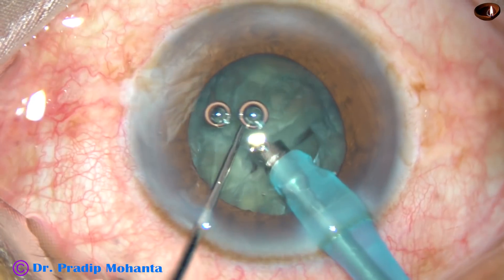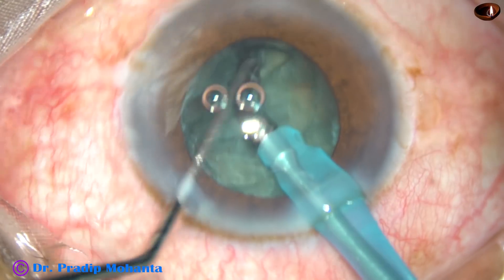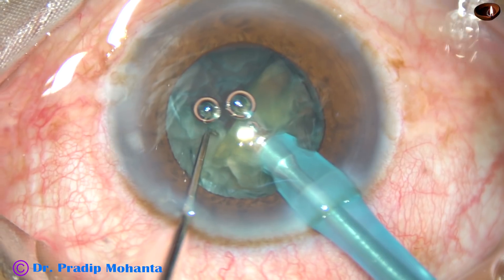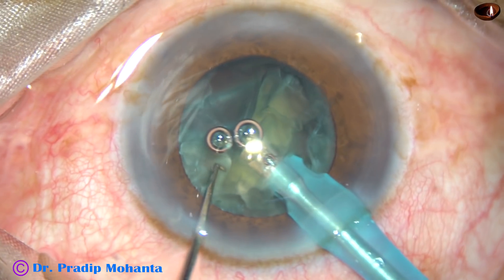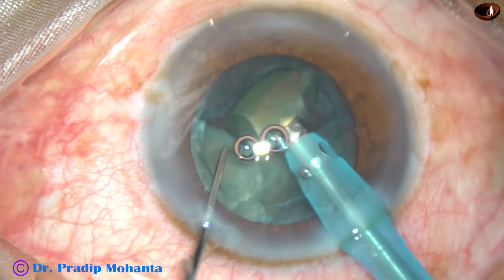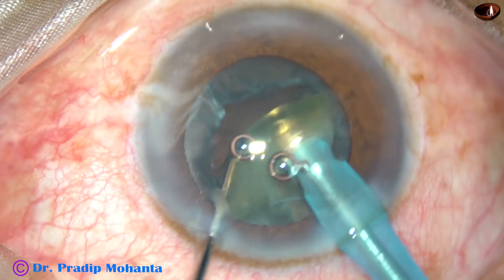If I apply vacuum, it will just remove the lens matter in front of the tip. So just bury it in the pit, support the nuclear mass, and use the chopper to slice the nucleus. This is the way for nucleus sclerosis of grade 1 plus or 2. Nuclear fragments are emulsified with ultrasonic energy and they are removed.